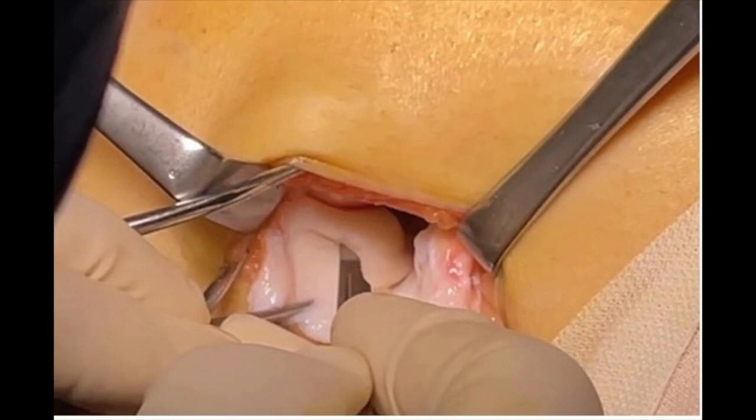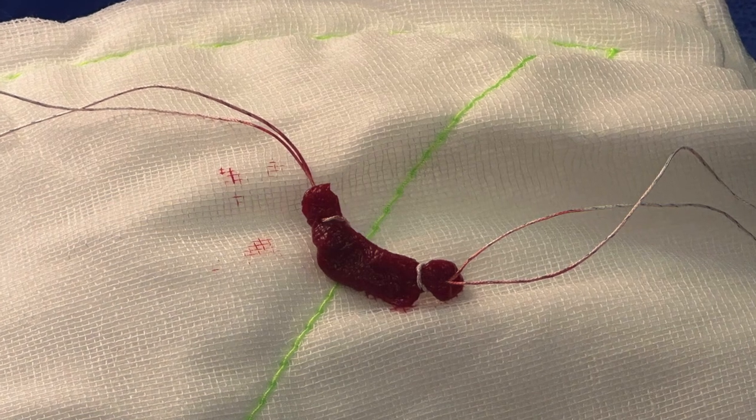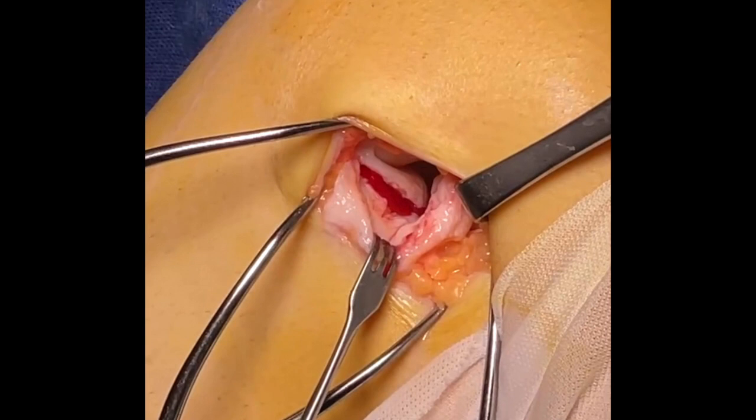A scalpel blade is used to incise the meniscus transversely. A diamond tip rasp or curette is used to debride the degenerate tissue and stimulate healing. An autologous fibrin clot is prepared and then placed into the defect.